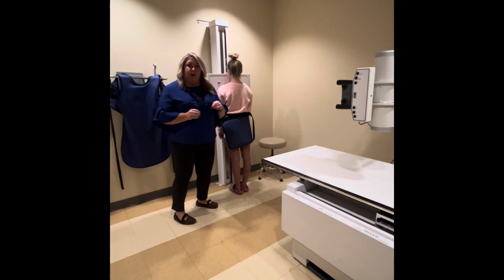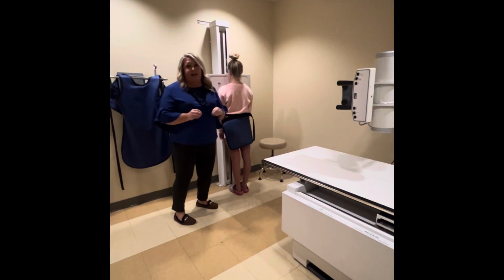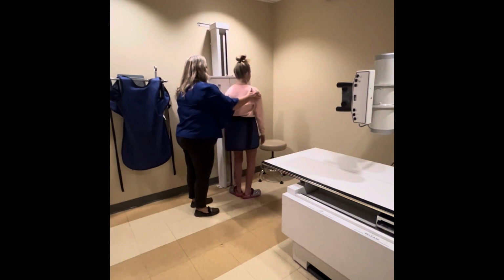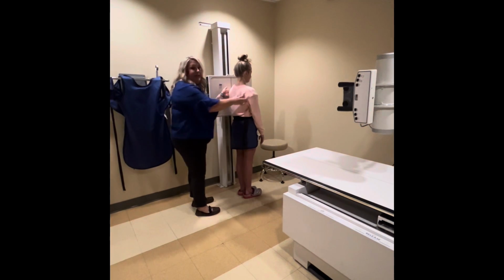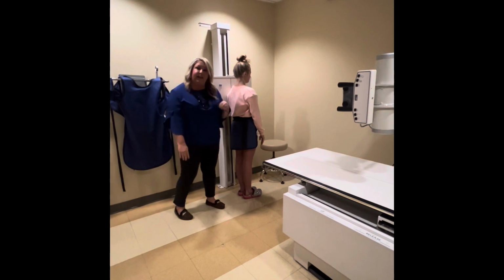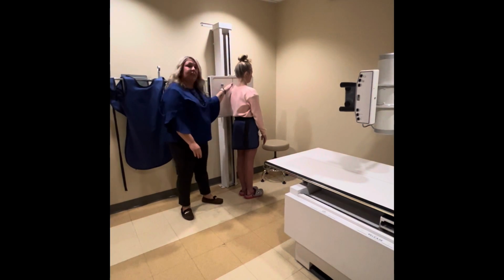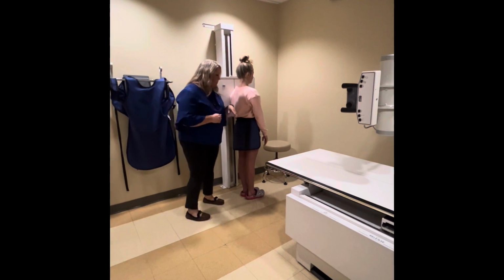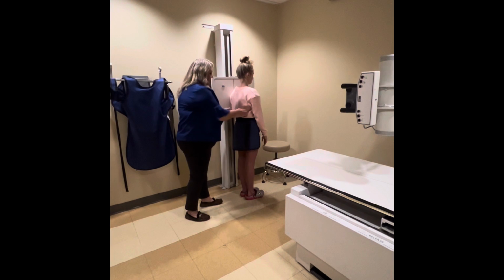So the second part of our chest x-ray is a lateral radiograph. So for the lateral, we're going to turn her to face this wall. Her left side will be against the image receptor, or the bucky rather. The reason why we do the left side is so that the heart is closest to the image receptor, and that'll reduce the magnification of the heart. So her left side is against the board.